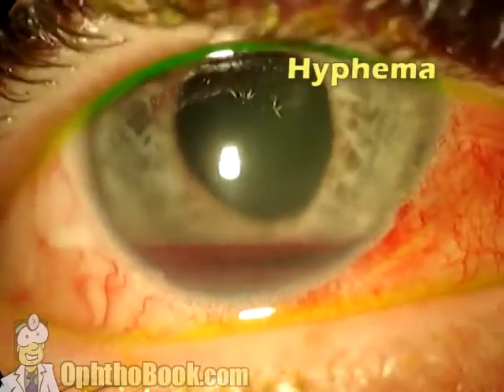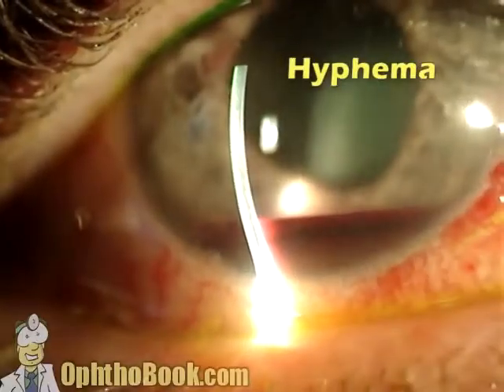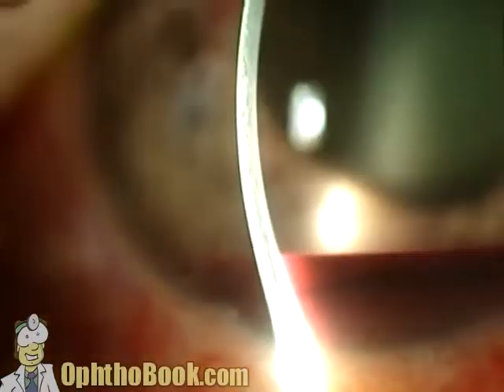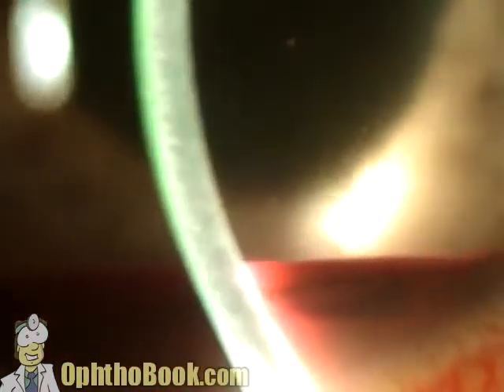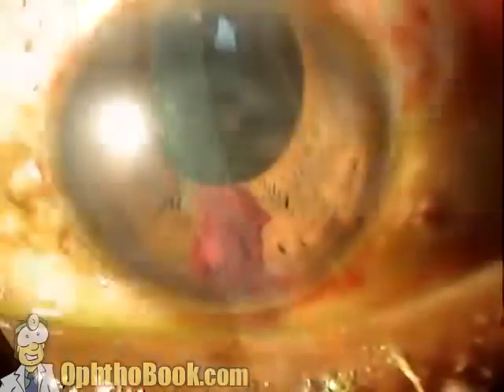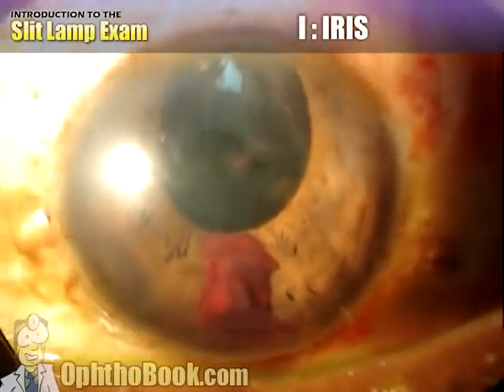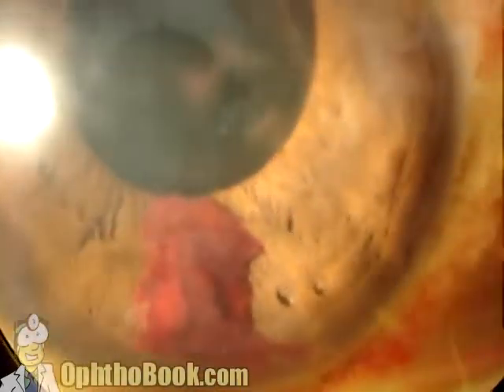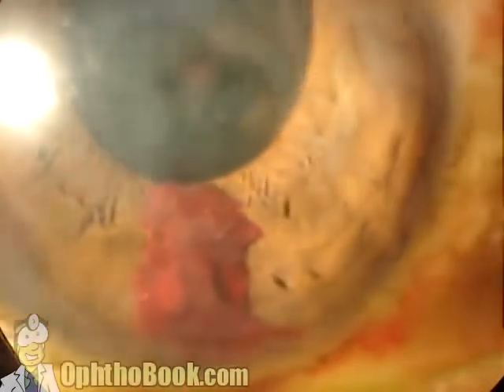Blood is heavier than water, and so this is our hyphema, and it's sunken to the bottom of the anterior chamber, and it's very easy to see here. And if you look closely, you can see there's 2 layers of blood, a fresh one on top, and you can see that's really plastered right up against the back of the cornea here. This is a resolving clot on the surface of the iris, and this is what we always worry about with bleeding in the eye, because days 3 to 5, this clot starts to resorb, and you can get a rebleed.